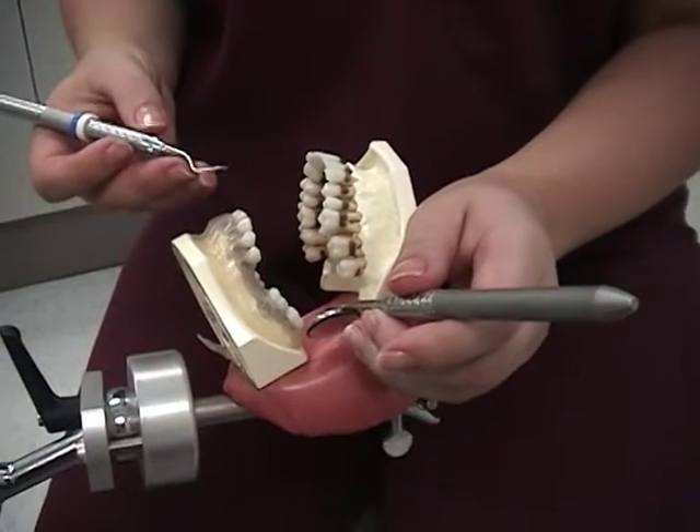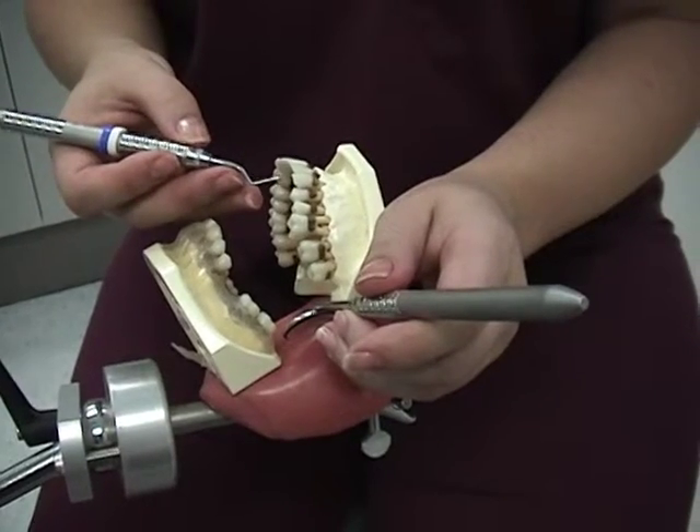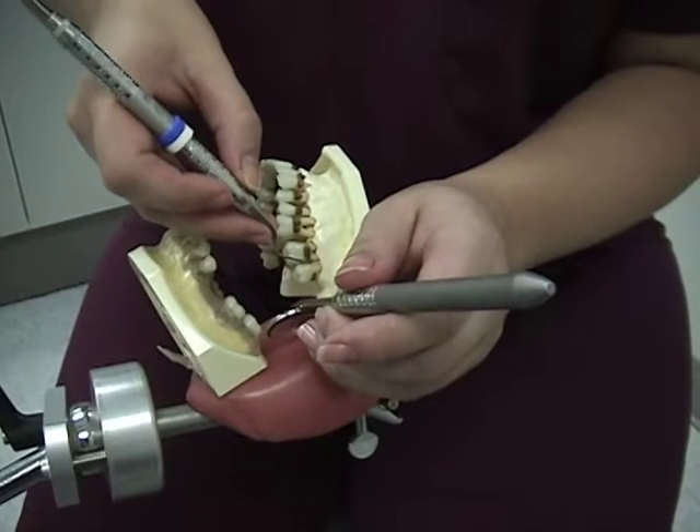With your dominant hand, modify the pen grasp: thumb, index finger, and middle finger in the correct position. Then establish the fulcrum with your dominant hand as your finger rest.